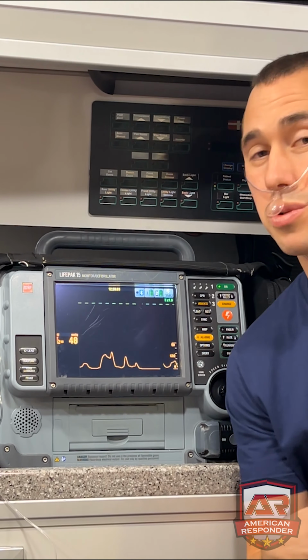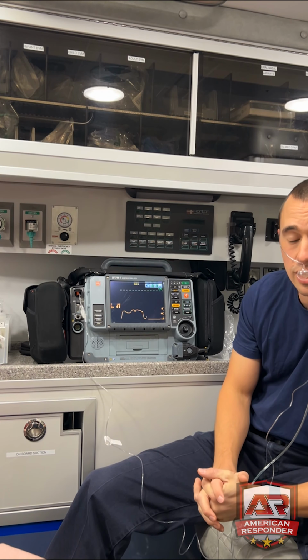Now, what are some of the waveforms we're looking for? One is shark fin. Shark fin is an important one for differentiating COPD versus CHF. With a COPD patient, we are looking for wheezing, and we're looking for shark fin. Sometimes you have diminished lung sounds with COPD patients and you can't really hear very well. In those circumstances, waveform is very important. Nasal capno is very important for your breathing problem patients, and determining the waveform helps you get the correct diagnosis. Give them a neb treatment if they have shark fin, and confirm that it is in fact COPD.